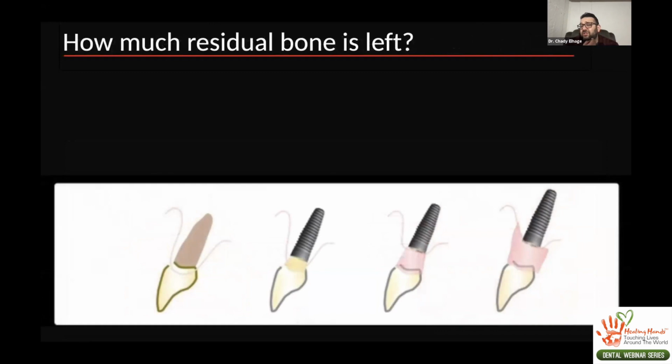This just kind of shows you the difference of when you're looking at a natural tooth versus a single implant restoration versus a hybrid or a full arch restoration, taking into consideration the incisal edge in each photograph does not change, but you can see how your respective implant leveling and implant position can change from treatment to treatment.